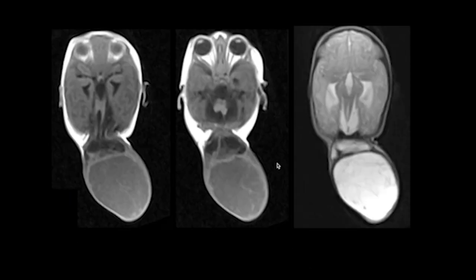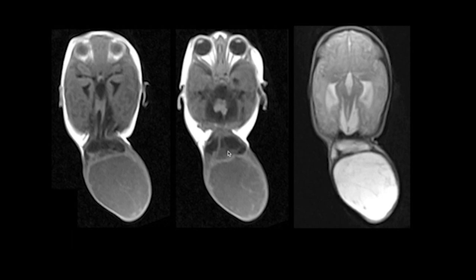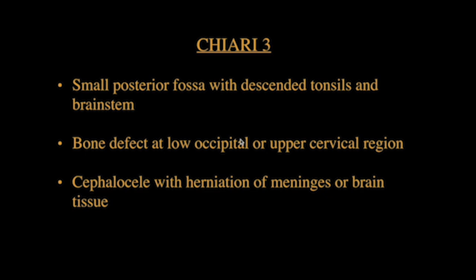This is another case where there is a bony defect in the occipital region with herniation of meninges and brain tissue, forming a large encephalocele — diagnosed as Chiari 3 malformation. Chiari 3 will have Chiari 2 features plus a bony defect in the lower occipital region forming a cephalocele with herniation of meninges or brain tissue.